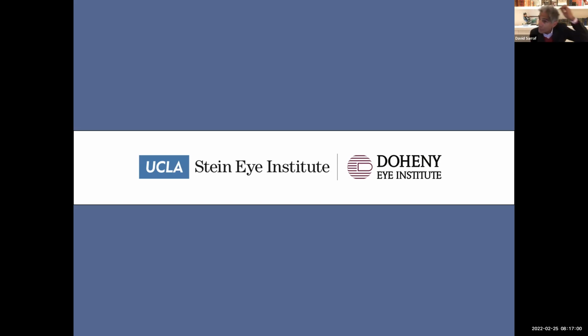And that has actually been more recently, I think, understood better with the advent of OCT angiography. Although in the 90s, the Querques group out of Milan showed that neovascularization can be present with ICGA in the absence of fluid. And now with OCTA, we're seeing that phenomenon much more commonly. And the group out of Miami, led by Phil Rosenfeld, were the first to show it with OCTA. And so you can see neovascularization in AMD patients.